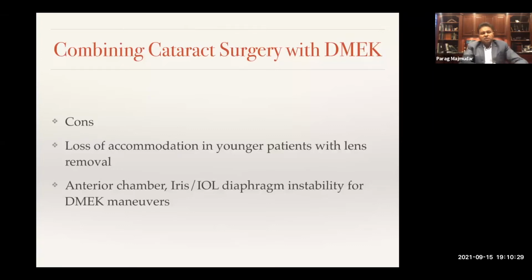Another disadvantage, of course, of cataract surgery is that most of the patients who are on the younger side are going to have a significant loss of accommodation. Now, if they have a cataract, I don't think you can avoid it. And I think you have to accept that this is one of the complications or side effects, if you will, of cataract surgery. But in that situation that you're doing the procedure for someone who has a cataract, you're obviously improving their visual acuity. And at that point, that certainly takes precedence.